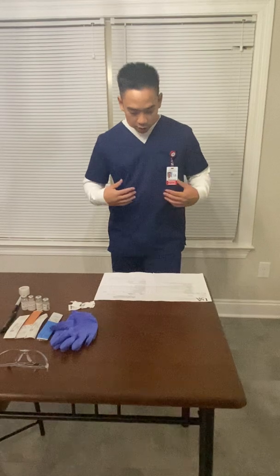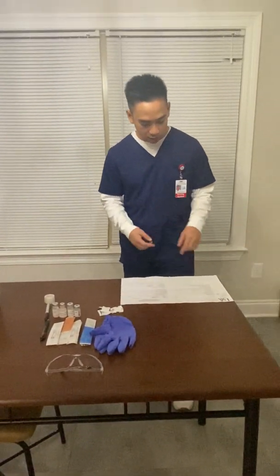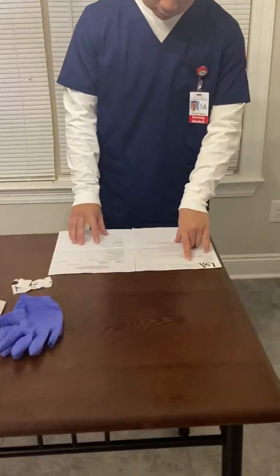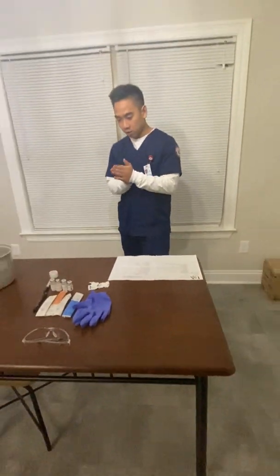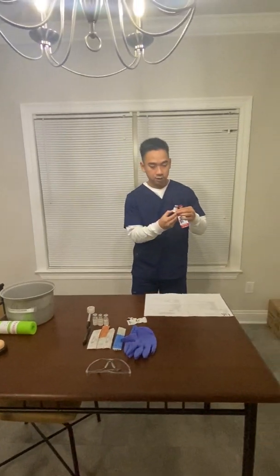After you do that, you are going to assess the allergies using the same 2 sheets. So allergies, penicillin. After you do that, you're gonna perform hand hygiene. You're gonna grab your medication. For me, it is heparin.